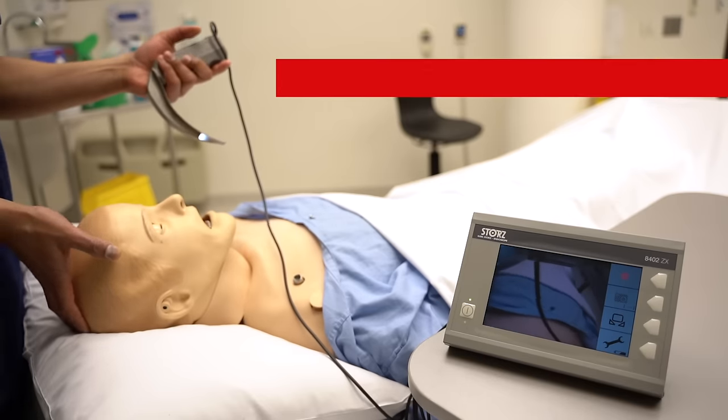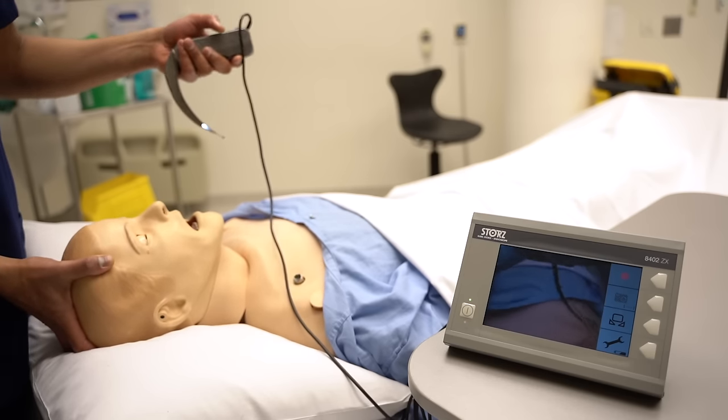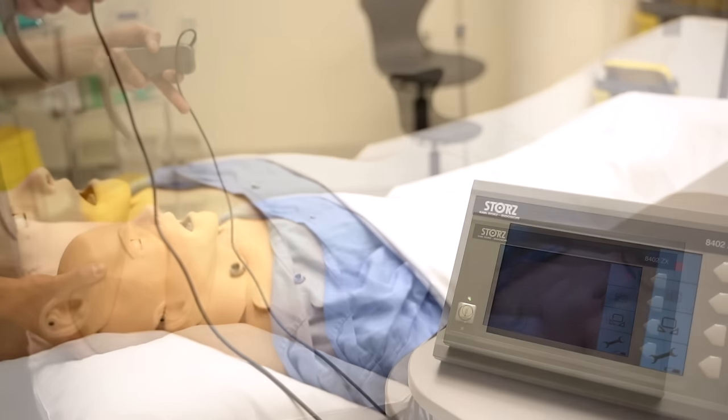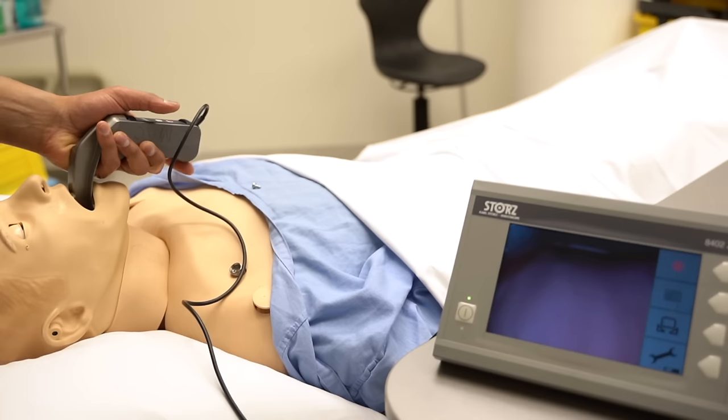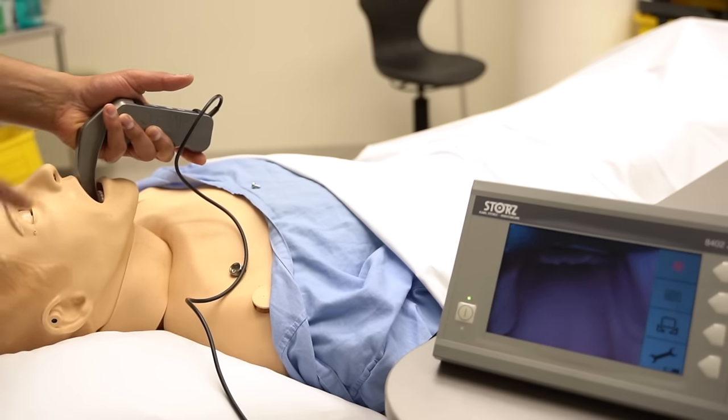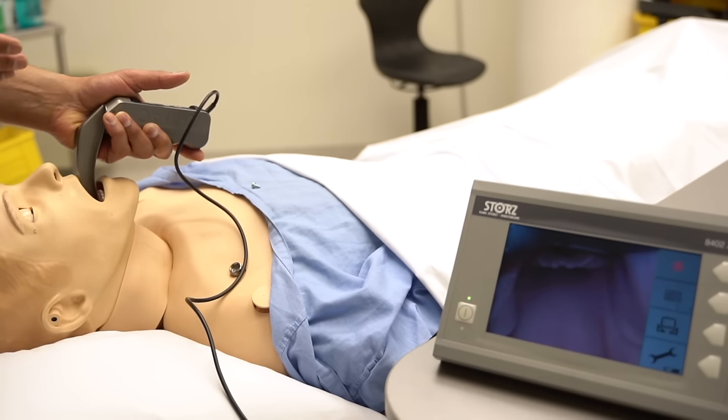Just to demonstrate with a video laryngoscope: the first step is to get my right hand on the head to angle the neck and head back, which opens up the mouth giving a much better trajectory to the trachea. As I go in, I go to the right side of the tongue and sweep the tongue over to the left — it's hard to demonstrate on this mannequin because the tongue is fixed, but that's the step I would take. The laryngoscope blade goes directly back, then I follow the tongue all the way down to the vallecula. The next step is to lift towards the corner of the ceiling, which opens up everything and allows me to see down into the trachea. If I don't get a great view, I lift the head and get my technician or nurse to help support it while I get the tube into the right spot.